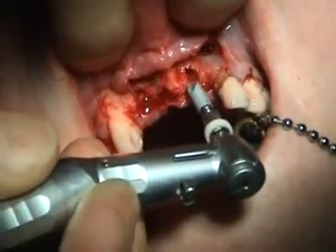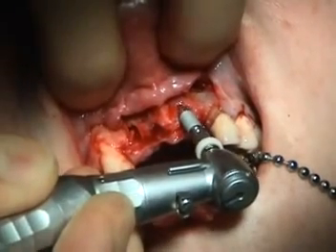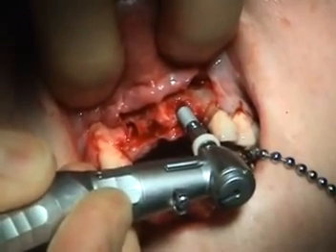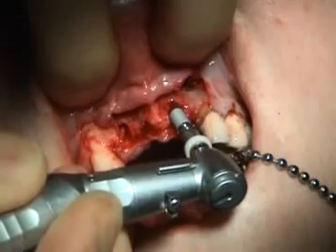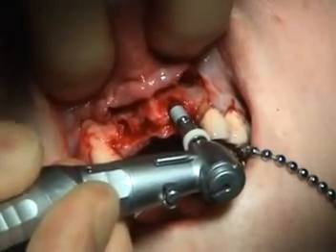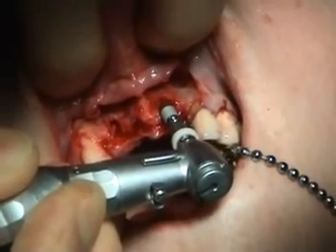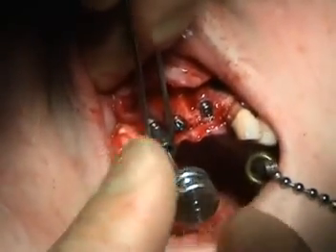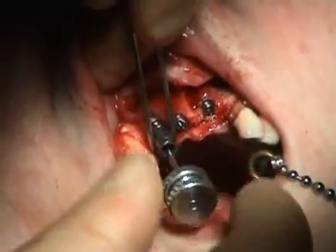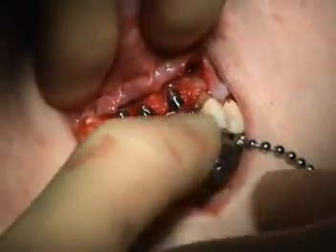The self-tapping implants can now be placed using a torque-controlled, slow-revolving handpiece. Once the implants have been placed, the driver mounts can be removed, prior to the fitting of protective cover screws.